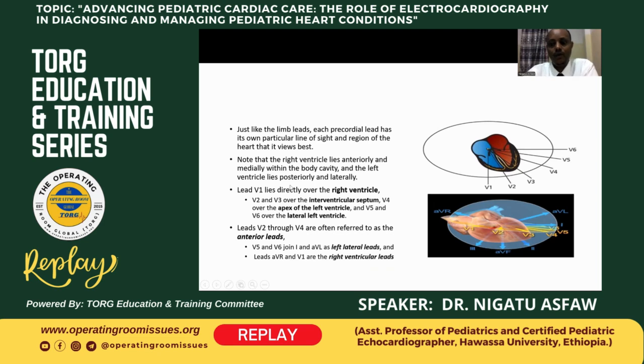And depending on where the electrodes are placed, it will show whether there is abnormality in specific chambers of the heart.